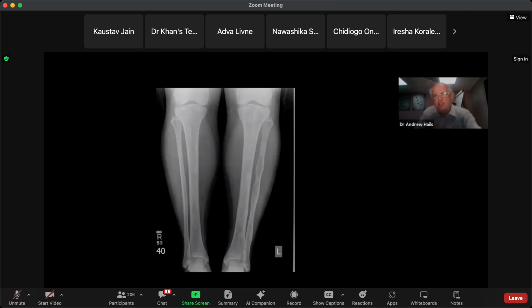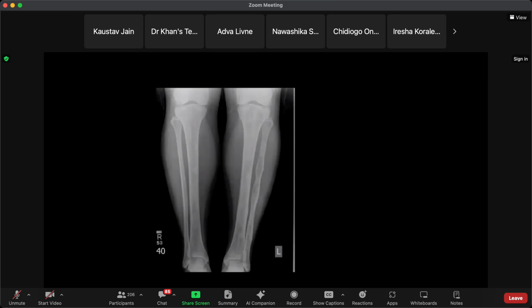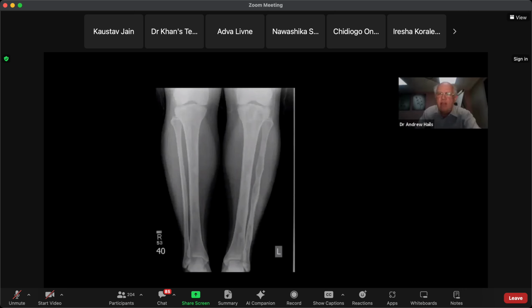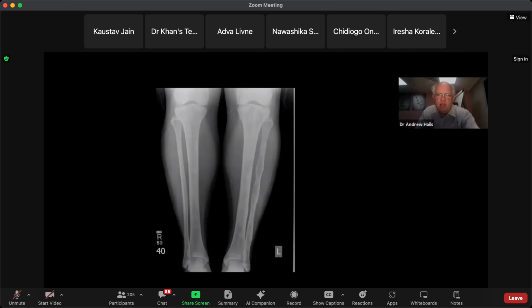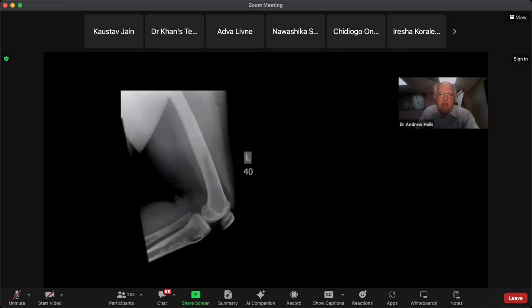this sort of ground glass area is bits of expansion. So this is fibrous dysplasia. Yeah, it's fibrous dysplasia, that's right. And you can't really look at that image and say, well, that's fibrous dysplasia. But you could look at it and say, well, it's not Paget, it doesn't really look like METs extending along the areas of the bone like that. It could be METs, but not so likely. It's not an arthritis, it's something in the bone, multiple bones. And this shows you that it's fibrous dysplasia as we've got here as well.